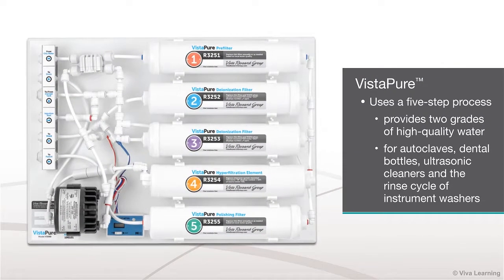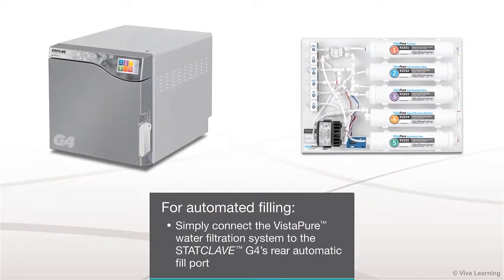Vistapur uses a five-step process to provide two grades of high-quality water for autoclaves, dental bottles, ultrasonic cleaners, and the rinse cycle of instrument washers. For automated filling, simply connect the Vistapur water filtration system to the StatClave G4's rear automatic fill port.